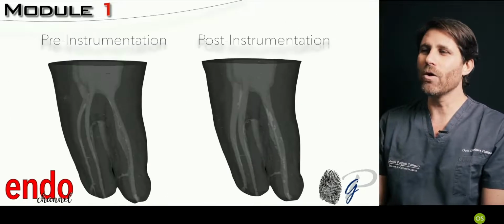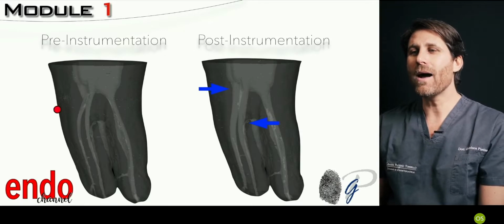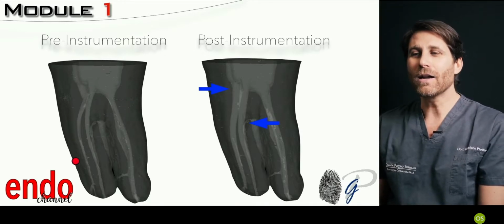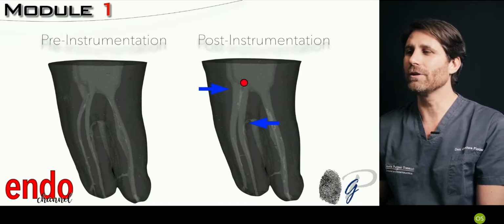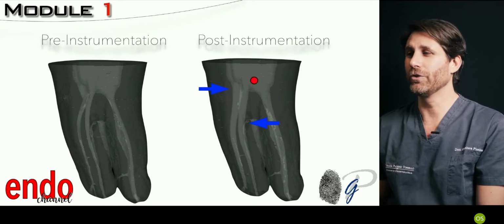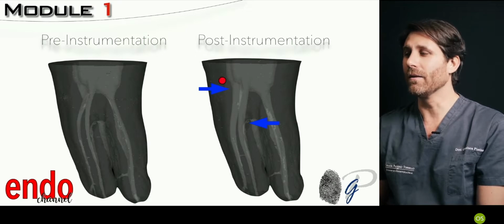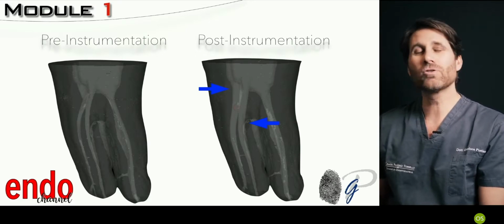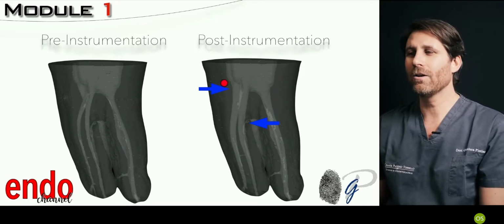So the aim was, given the pre-instrumentation slide and the amount, direction and trajectory of the root canal that is always like this, to maintain as much as possible this trajectory even in the coronal third. Do not make a straight line access here. Maintain this, because today we have instruments that permit us to maintain this triangle of dentin.